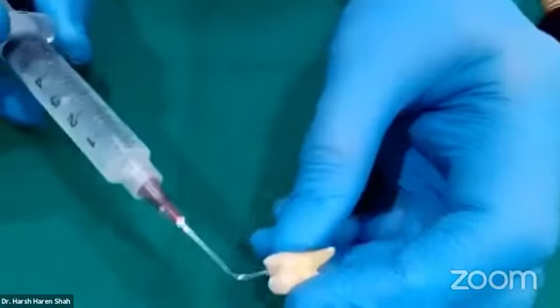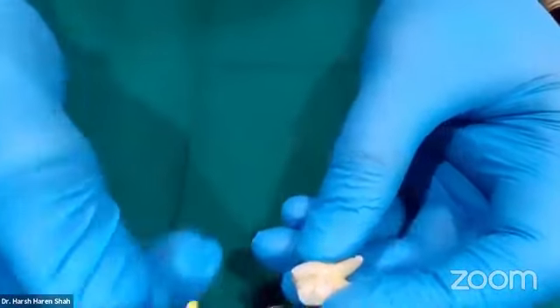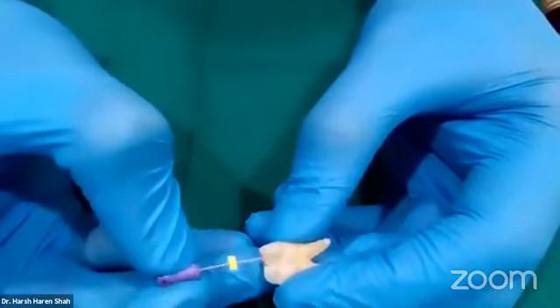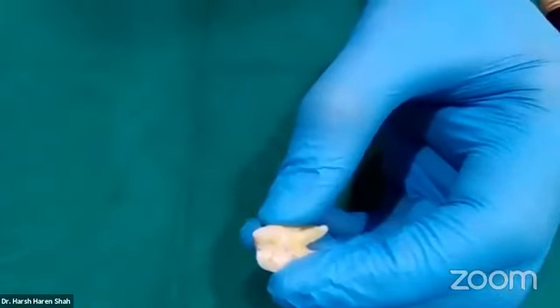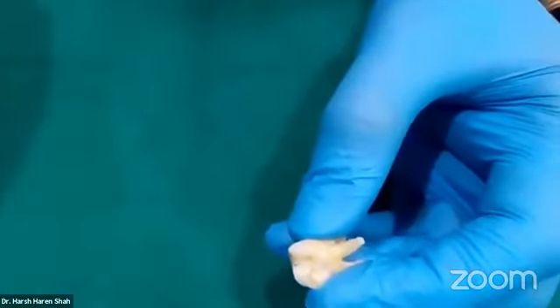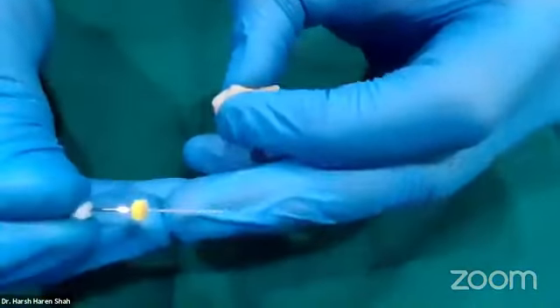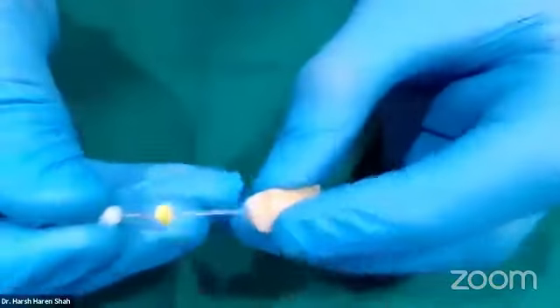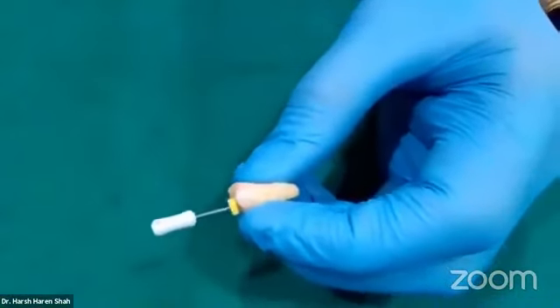Once my glide path, once my 10 number K file job is done, just like the manual method, I will irrigate this mesiobuccal canal. I will recapitulate with the same 10 number K file. And when you're using these reciprocating hand pieces, you will generally not need the use of a 12 number. You can directly jump to 15 number. So my stopper is already set here at 15 millimeters. I will introduce it in the same mesiobuccal canal at the full length.